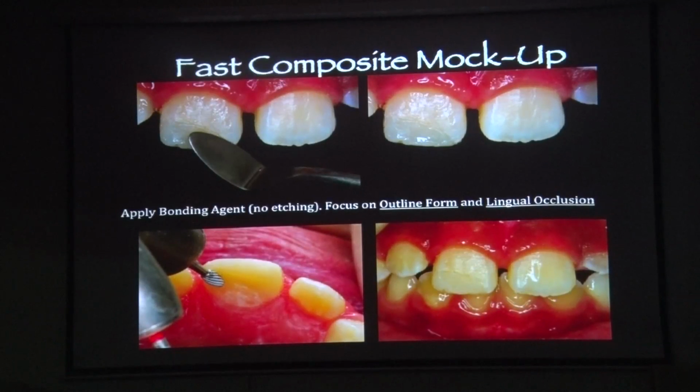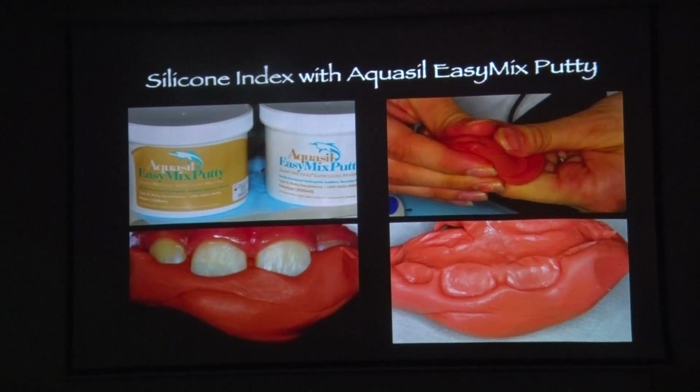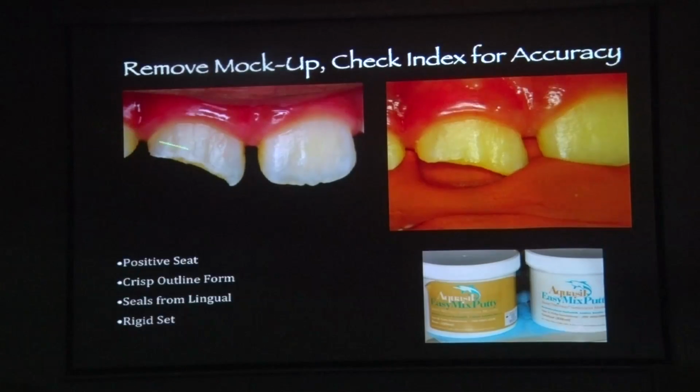Now if the patient is fine, the patient says I'm okay, then I immediately mix putty and make an index of the lingual which you have just built. You get your index ready here, so now you have your impression, you give your bevel, long bevel, scallop bevel, over edge, place the index in the patient's mouth, because you want this in 20 seconds. That's the whole objective. Say for example, the patient has come with an old class 4, but he has the lingual plane intact. Then you have the advantage of taking the template immediately in the patient's mouth.